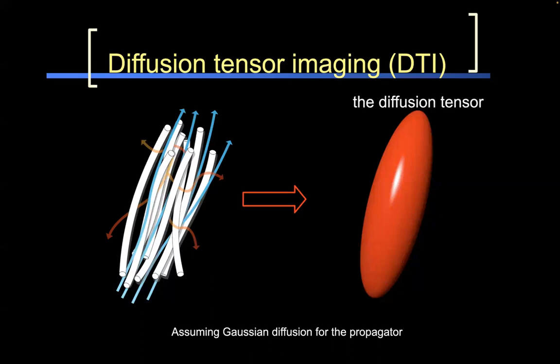So the diffusion tensor with 6 unknowns can be something between a sphere and an ellipsoid. And we'll get back to, and I'm sure people are already saying, oh, Max, you talked about crossing fibers earlier. It's coming. This is not a perfect model. It's a good step forward. And remember that there was a time before we had parallel imaging and before we had acceleration techniques where DTI was long to acquire. So acquiring more than 12 images was already a challenge. So we needed something better than just apparent diffusion coefficient, and DTI came along.